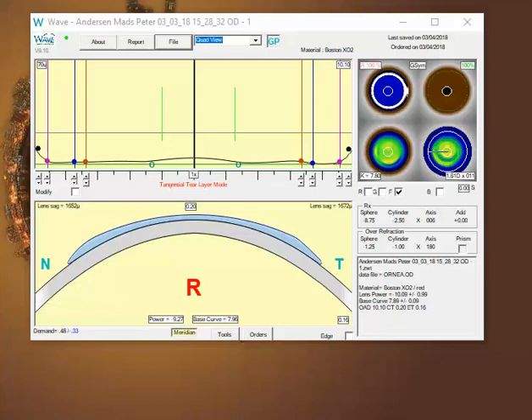From your request, it sounds like your patient is currently comfortable wearing a 10.0 diameter Wave contact lens. Since this lens is very similar in design, but they're noticing more discomfort, it's most likely an edge awareness issue or a landing area issue. If we look at your design, I notice you went to a 10.10. It may just be as simple as a little more awareness with the slight diameter change.